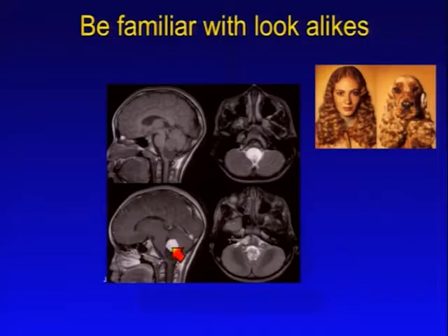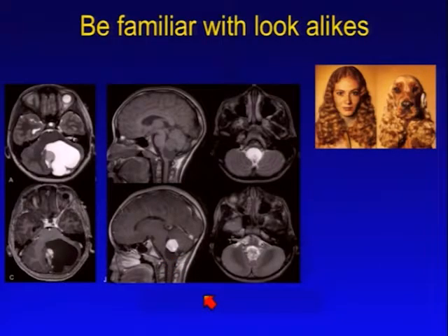Now, this is a solid cystic tumor. You agree? Posterior fossa. So this should be a pilocytic astrocytoma. But it is not complete.